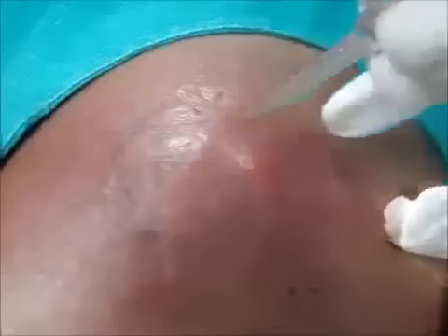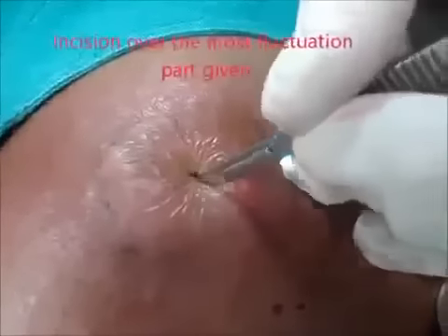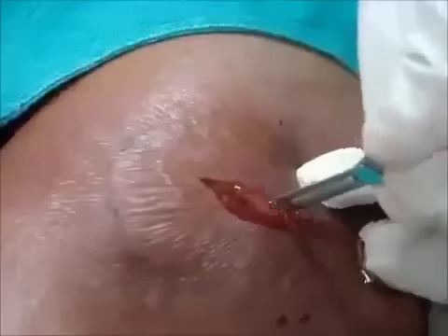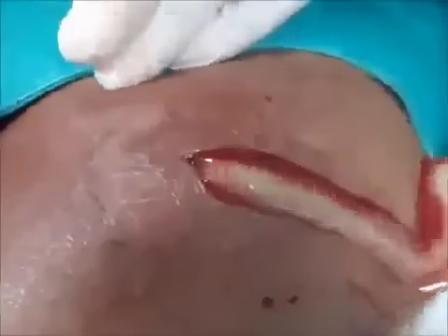Now it's time to drain the pus. A stab incision is given over the most fluctuating area. You can see the gush of pus coming out — a lot of pus was there and the pressure is releasing freely.